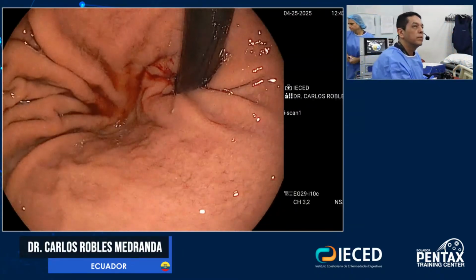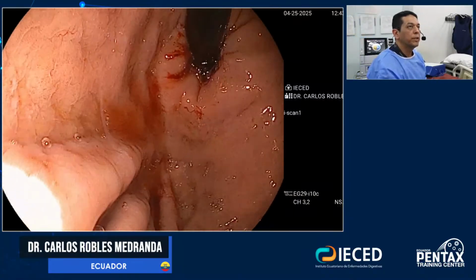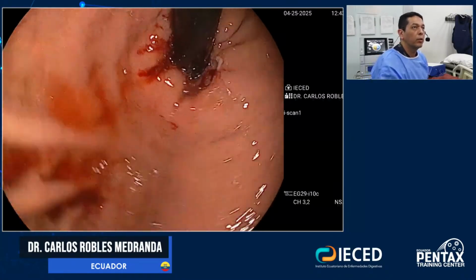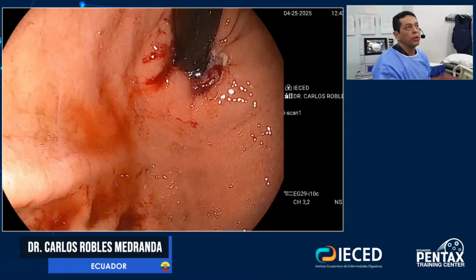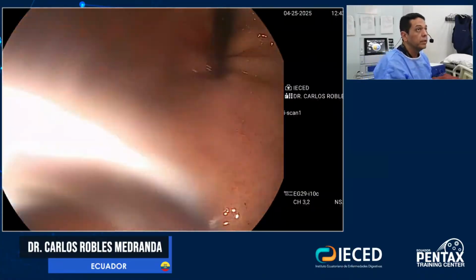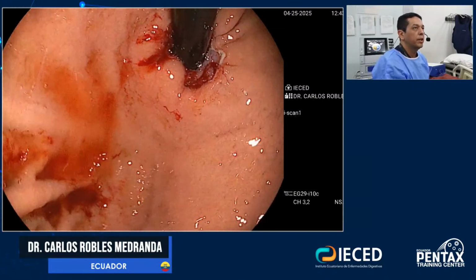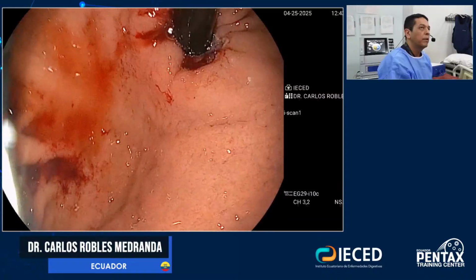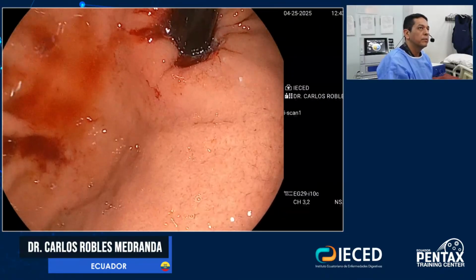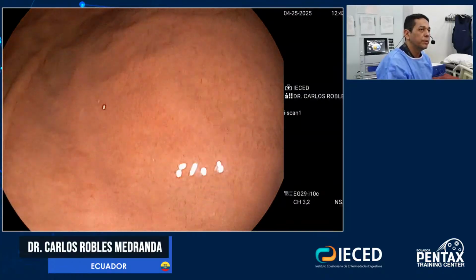So now, I need to make 220 degrees, and I want to show you how we do it. So normally I use Blue Boost. It's a hyaluronic acid, because I can burn much better and at much higher power when I am doing the ARMA technique. Okay. So we need to go until 3 centimeters.